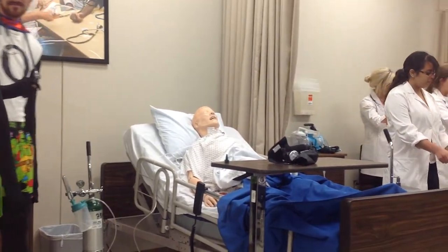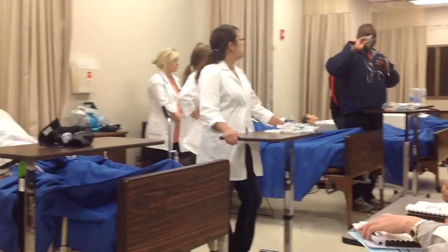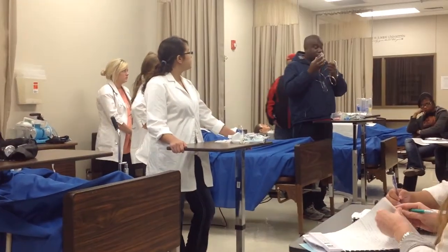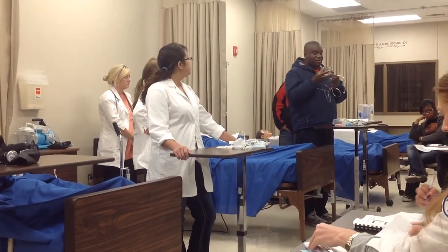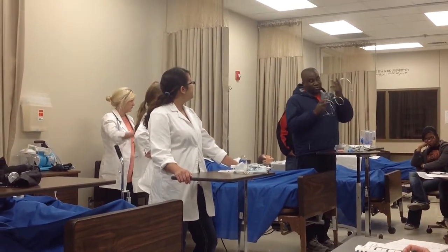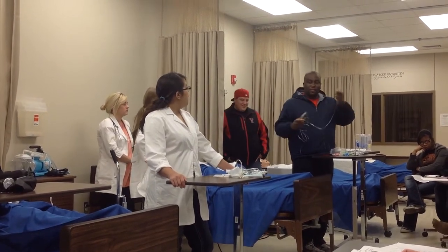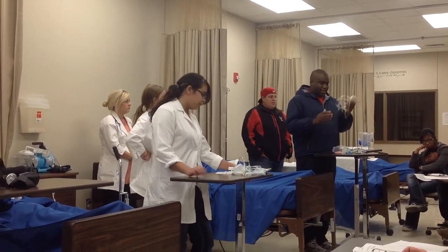Daniel's going to tell you about some of them. Oh, okay. So the first one I have here is called a simple face mask, and it usually goes on like this. It goes to the back of the head, and of course this is attached to your tank.